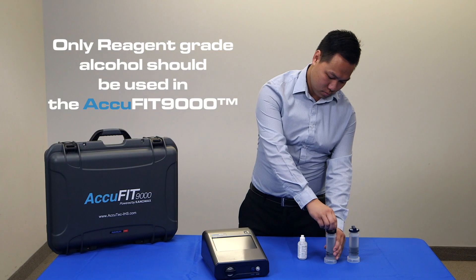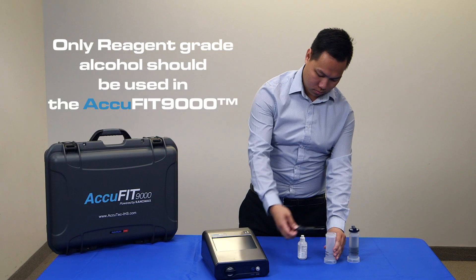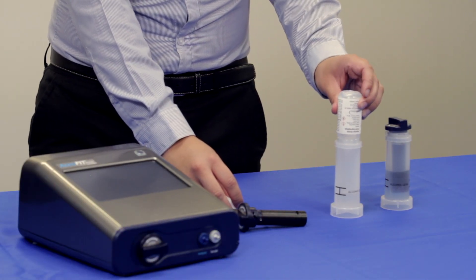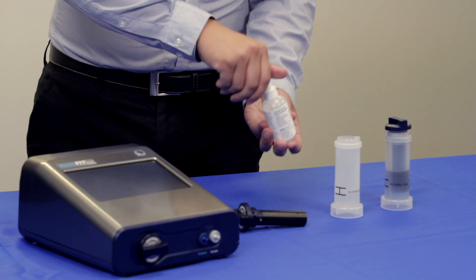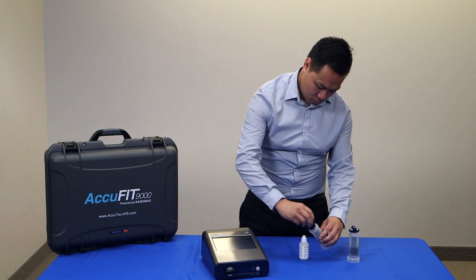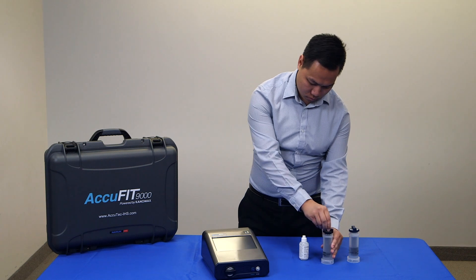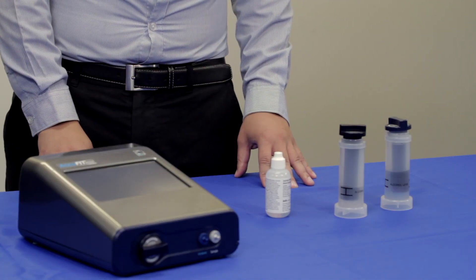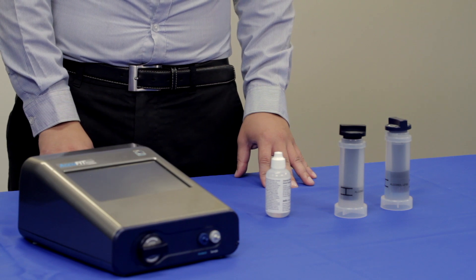Prior to startup, the alcohol cartridge should be recharged. Pour the included reagent grade isopropyl alcohol into the alcohol storage container and fill to the marked level. Next, insert the alcohol cartridge into the alcohol storage container and lock in place. The felt in the cartridge will then absorb the alcohol and can be used in the device after a few minutes.